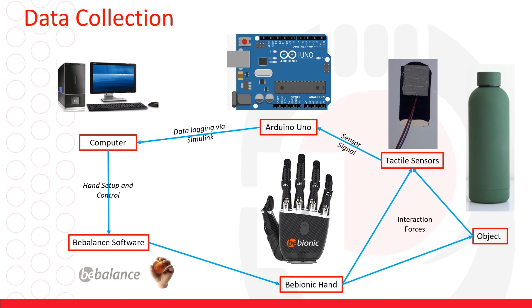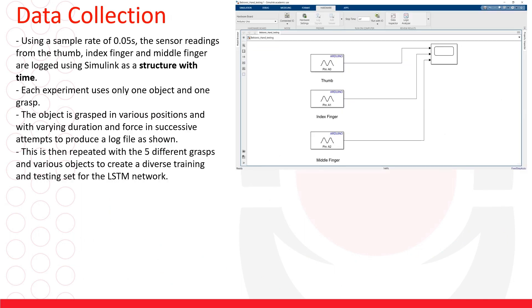This is the setup that we use for data collection where we perform multiple grasping experiments and we log the data from each experiment using Simulink and we save it as a structure with time at a sample rate of 0.05 seconds.